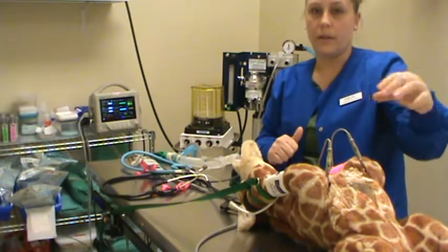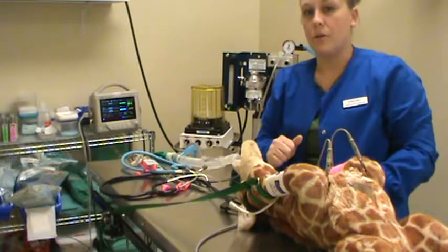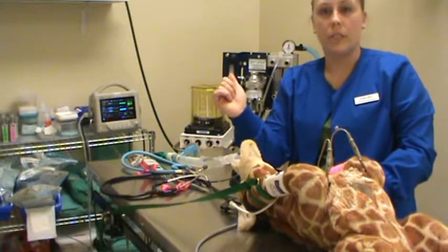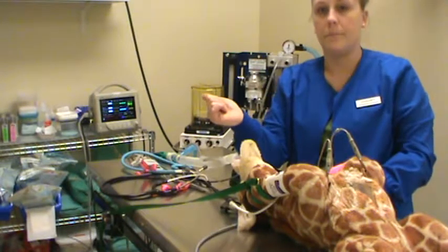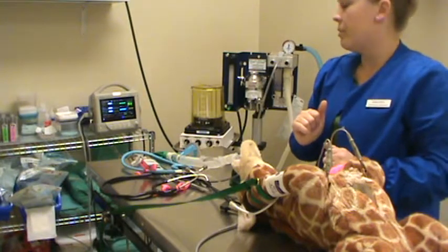So kidneys, liver are not getting enough blood circulation to keep them functioning. So you could actually cause permanent damage in the patient if the mean arterial pressure is below 60 for too long. So we watch that mean arterial pressure really closely.